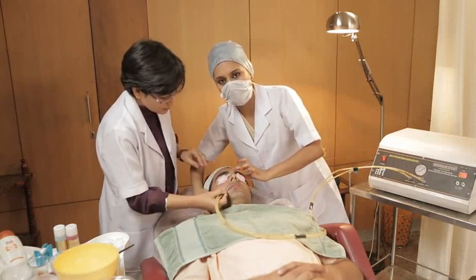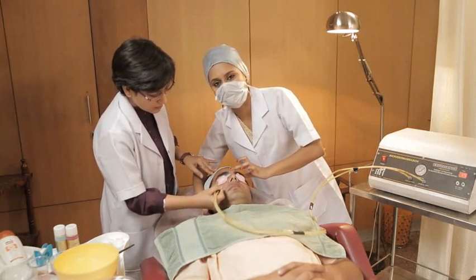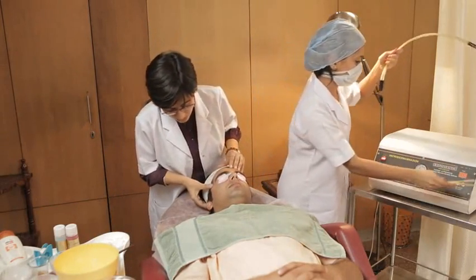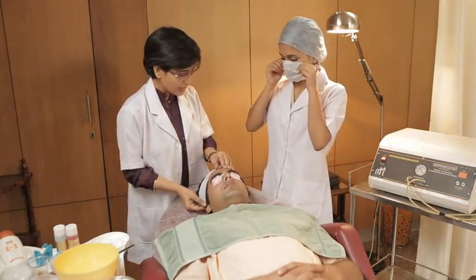This procedure is done for the whole face in sections, moving in an anti-clockwise direction. Mr. Arun, your treatment is now done. Kavitha, clean the face and as always check for dry patches or irritation.